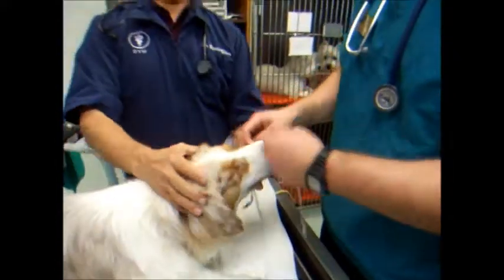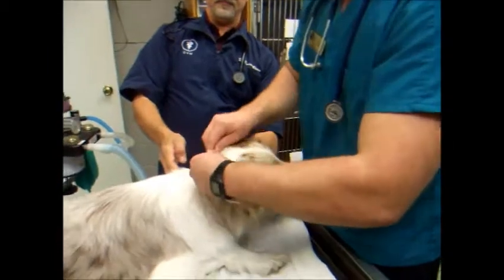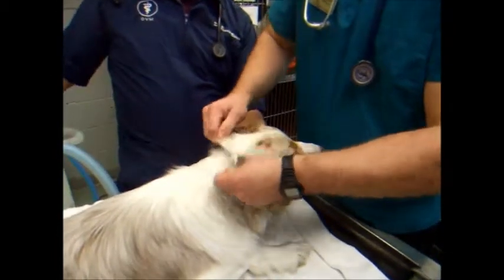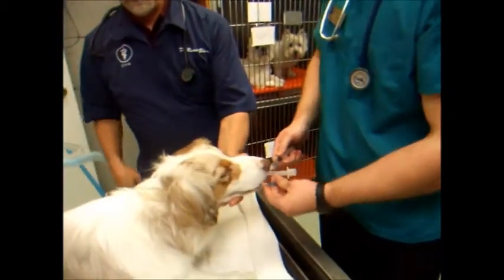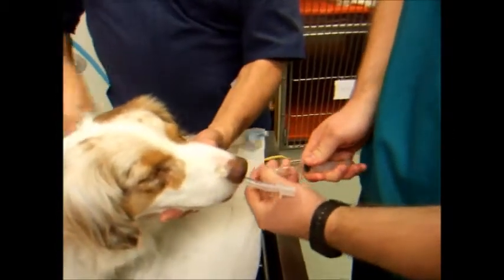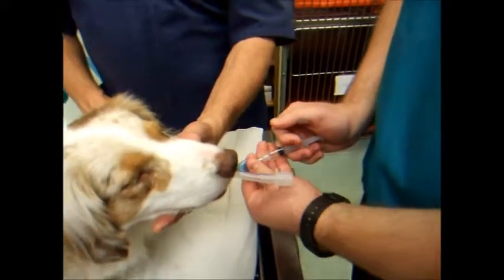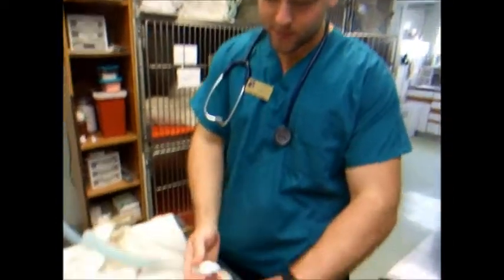Yeah, that's it. Alright, we're going to tie that back here. And then we're going to inflate the cuff with our syringe here. And we are going to push until I have a little bit of resistance in the syringe. Just like that. I'm going to go ahead and apply some artificial tears to her eyes to lubricate them.